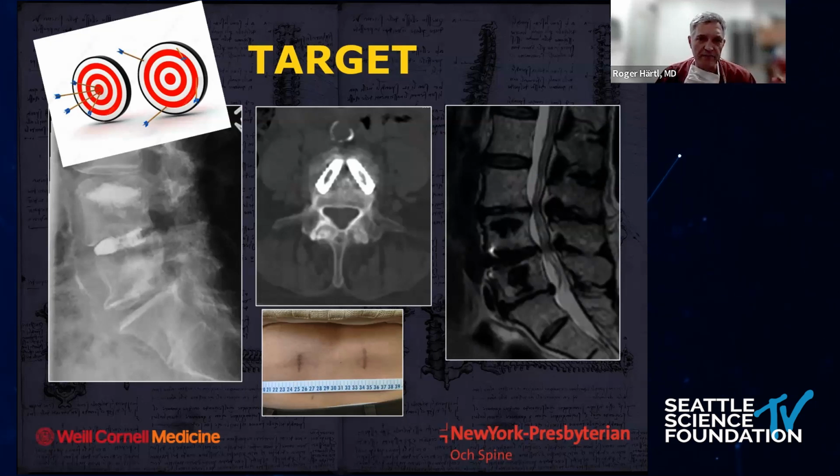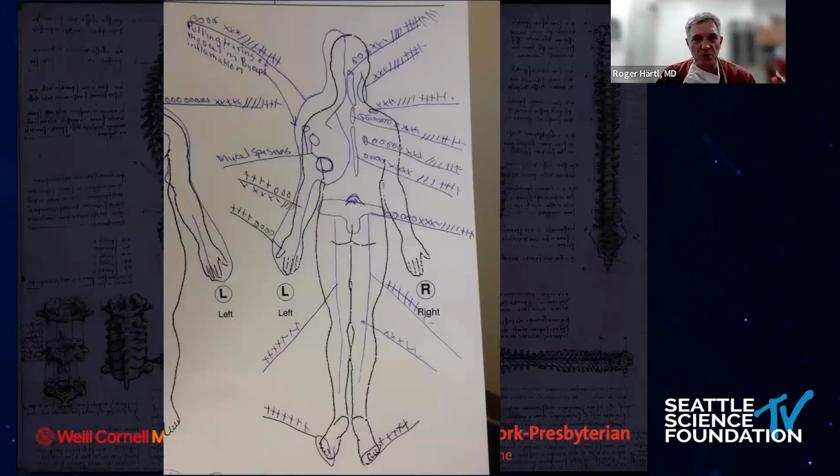So they missed the boat here. They did a beautiful MIS operation, but target was totally off. Patient selection was totally off.